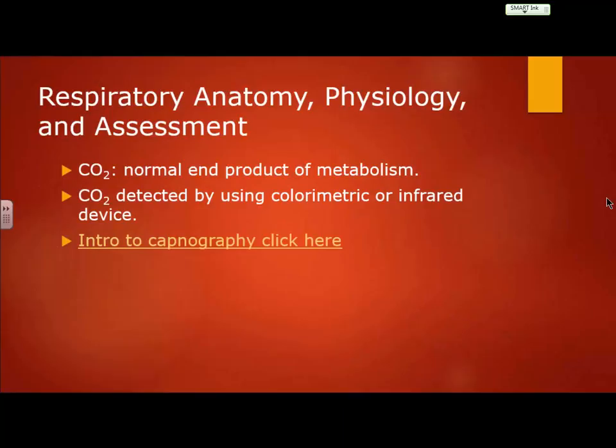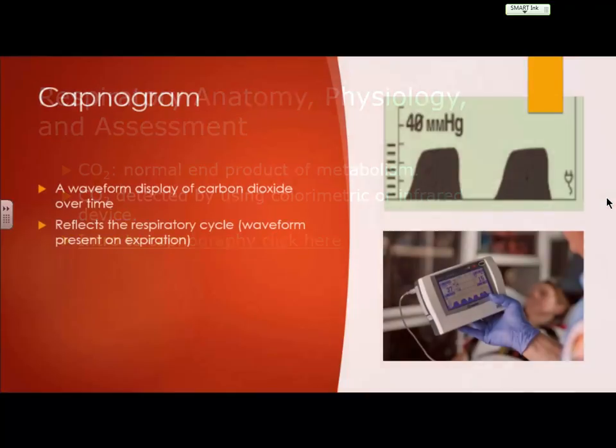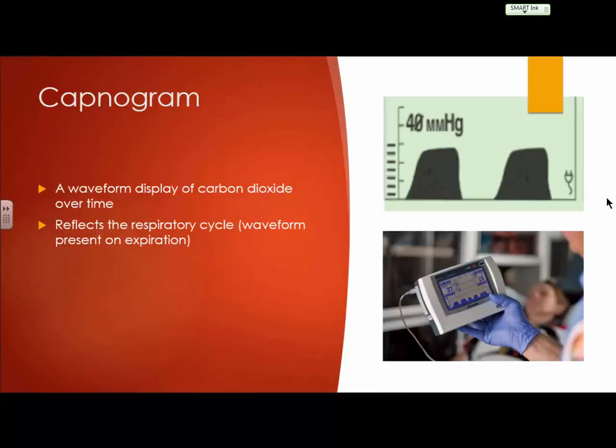I have a question. You said you can tell lengths of expiration by how wide or how narrow it is. Could you also deduce from that whether or not they're acidotic or alkalotic? Not with that, but you can. This can give you an indication here, okay. And then looking at their overall perfusion status and everything else that goes along with that. Now you're not going to really get a lot from acidosis, alkalosis from anything here but the numbers.